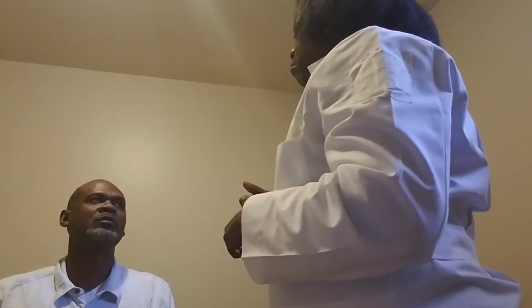The next thing I'm going to do for my client is test his hearing. First, I want to take my tuning fork and place it at the top of your head. You let me know if you can hear the vibration in one ear, the other ear, or both ears equally, okay? Okay. It's equal.